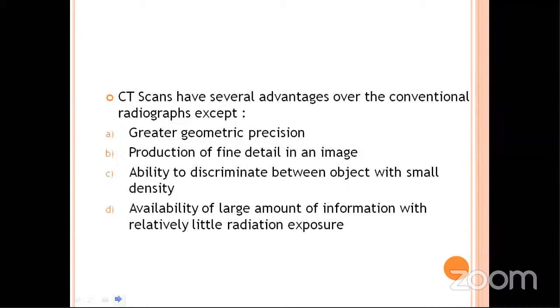Okay, CT scans have several advantages over the conventional radiograph, except. So there is availability of a larger amount of information with relatively little radiation exposure.